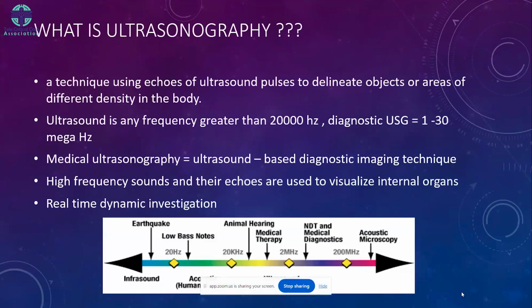Before we understand the technique of ultrasonography, we first need to know what it is. Ultrasonography is basically a technique which uses the echoes of ultrasound pulses, which are produced from a particular transducer to delineate objects or areas of different density in the body.